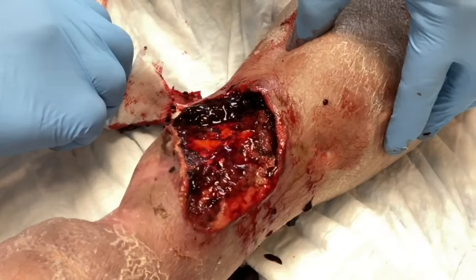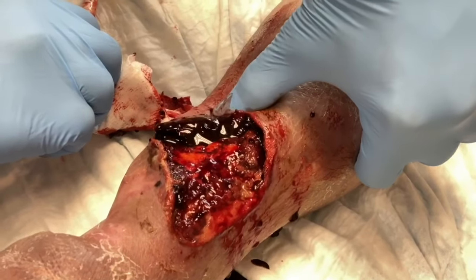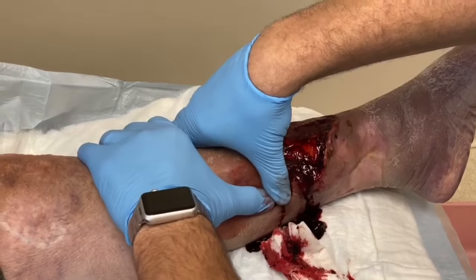It's very crucial that you use pressure to push out the dried blood because if any of it's left behind, it can create problems. And you can see here we're milking all of the hematoma out just to make sure we've got it all.